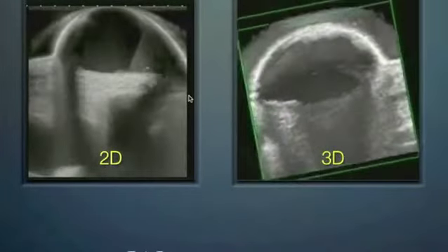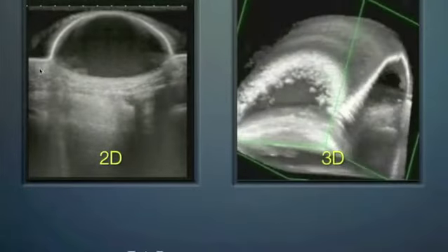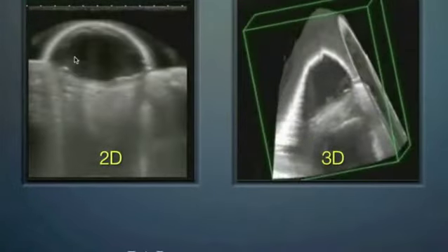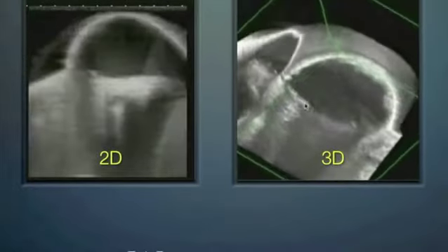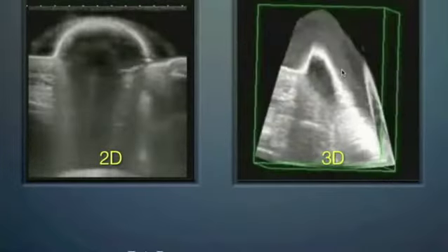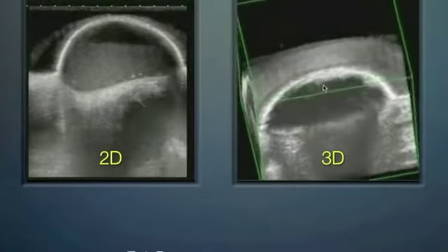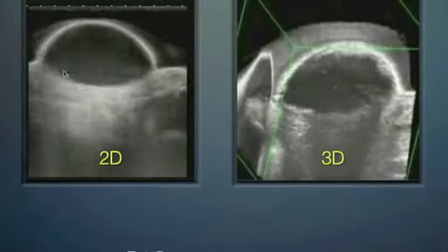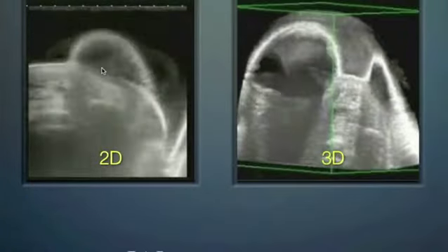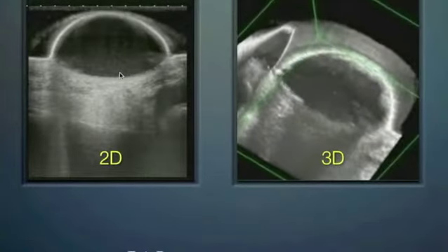Here's a patient with a large hemorrhagic bulla on their foot dunked in a water bath. This is the 2D image of that structure — fanning through it, all the meniscus seen is the hemorrhagic material. We get very good visualization in 2D mode. Moving into 3D mode, the machine captures images as we fan through and reconstructs a three-dimensional image we can tumble around to appreciate the depth and full extent of this structure.